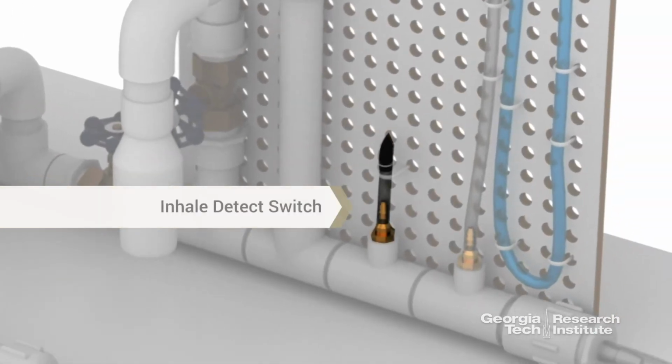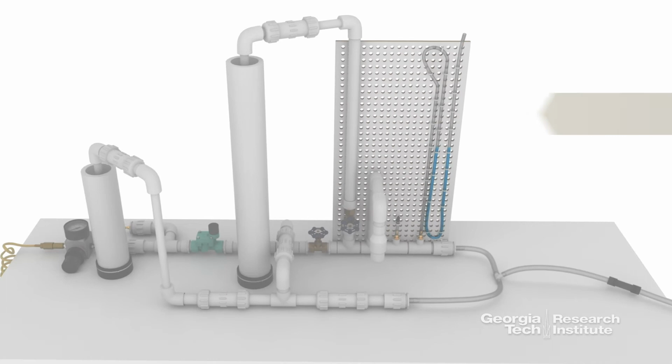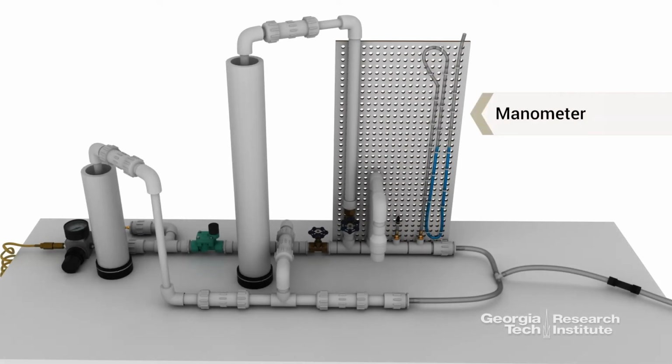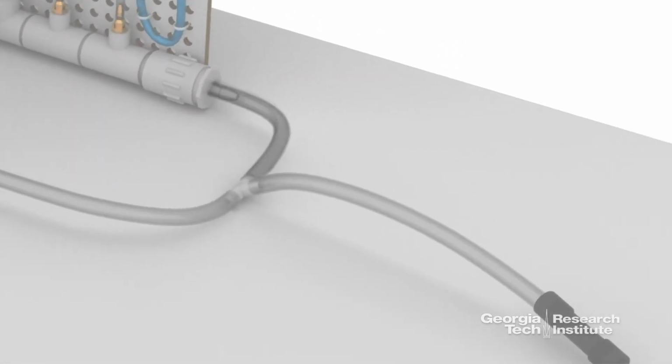This is the inhale detect switch. It's effectively a brass fitting with a penny, and whenever the patient inhales, the two make contact, and that tells the controller that an inhale has happened. And then we have the manometer. The manometer is how we set pressure and measure pressure. You look at the graduations on the side here, we go from 0 up to 80.